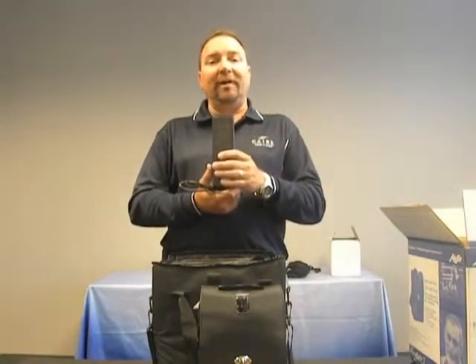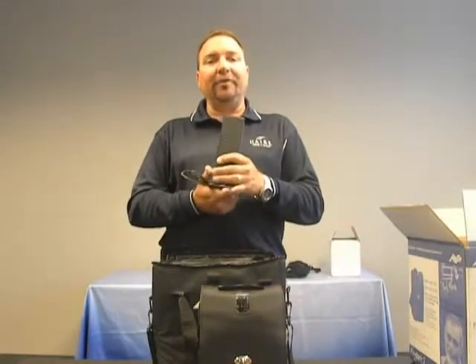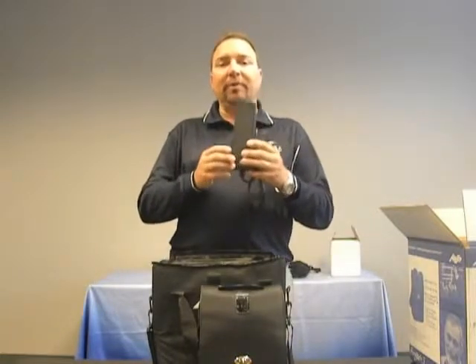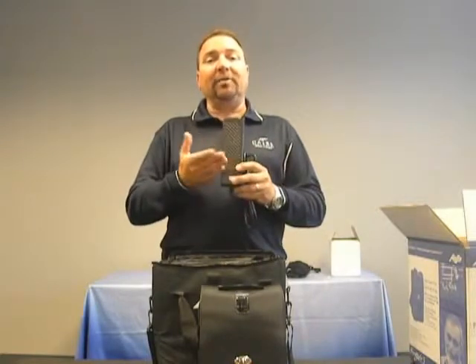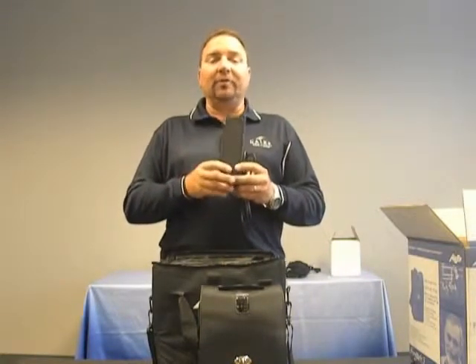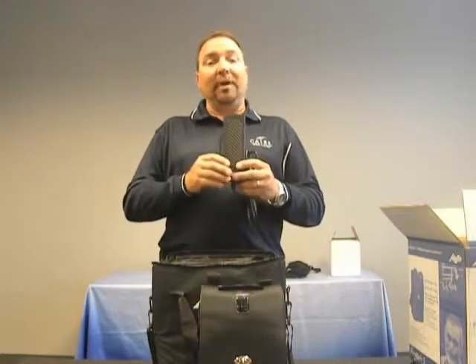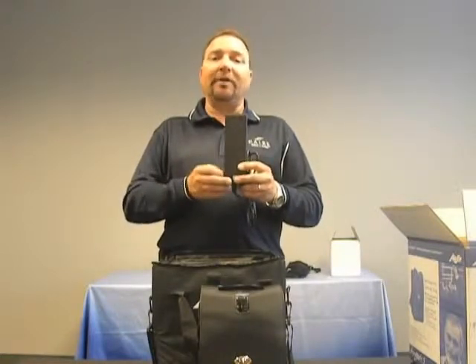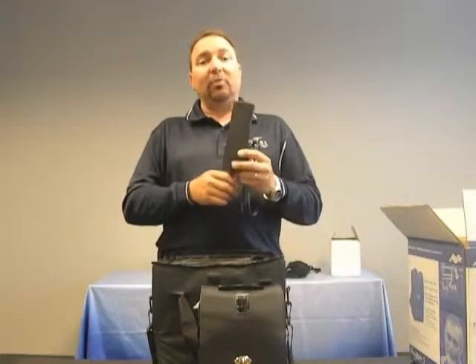Anytime that the FreeStyle 5 is plugged into either AC or DC, it will charge the battery simultaneously while it's in use. It's also important to note that the AC power supply can be converted for both 110 and 220 volt environments. So if you're thinking about taking a vacation to another country where the power current may be 220 volts, you can simply order directly through your oxygen provider the power cord that goes for the country in which you are traveling.